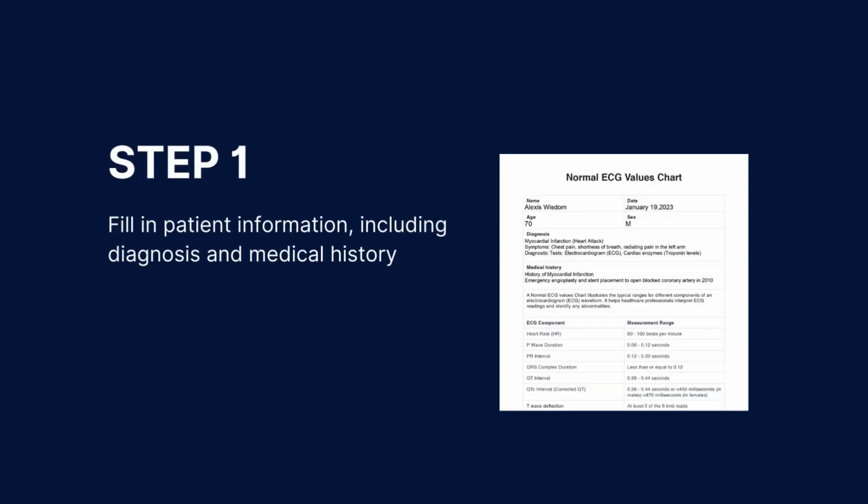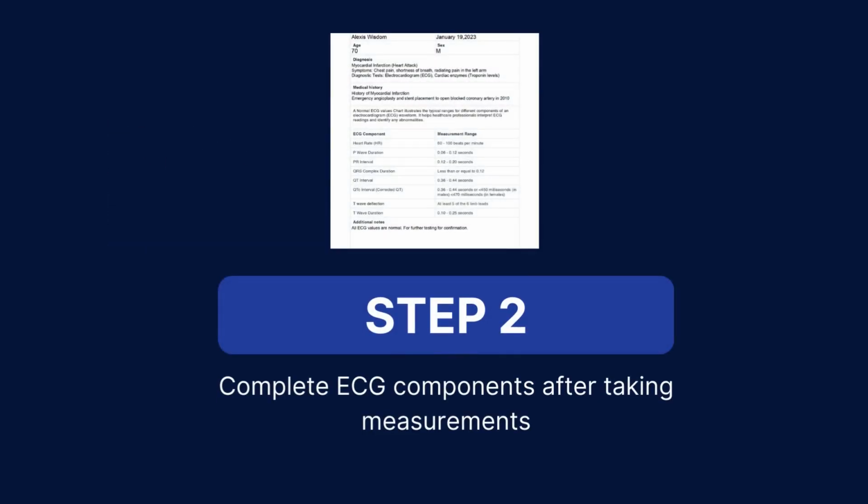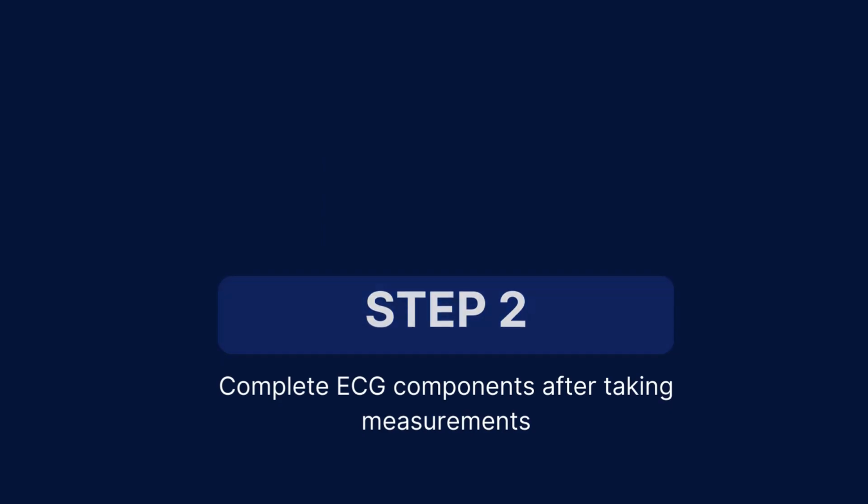The first step is to fill in patient information, including the diagnosis and medical history. You will then need to complete the ECG components after taking the relevant measurements.